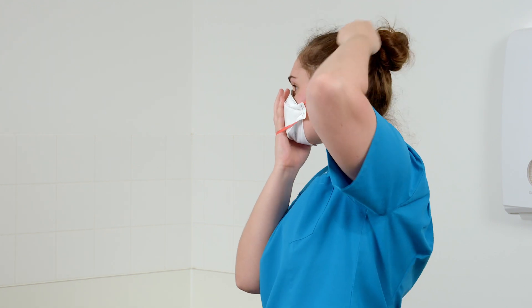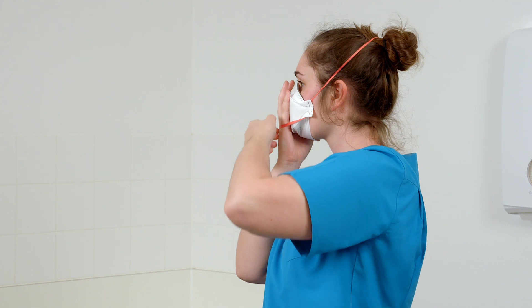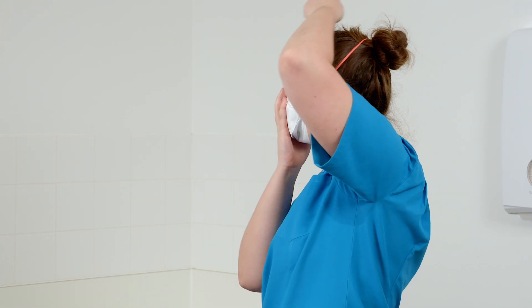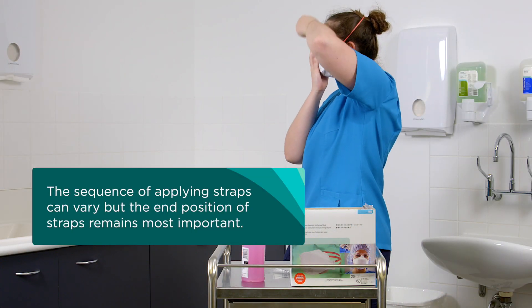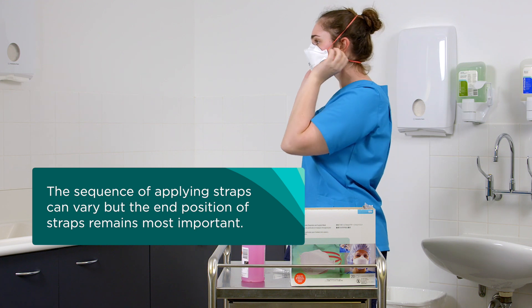Hold the respirator under your chin with the nose piece up and pull the straps overhead. Pull the top strap over your head and position it high on the back of the head. Pull the bottom strap over your head and position it around your neck and below your ears. Straps must not be twisted. The sequence of applying straps can vary, but the end position of straps remains most important.